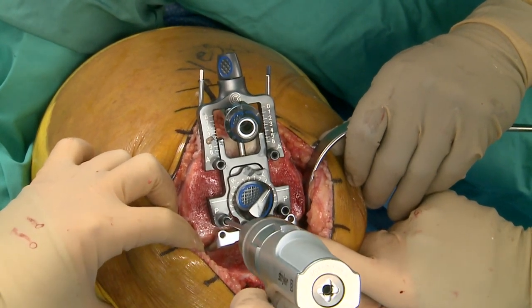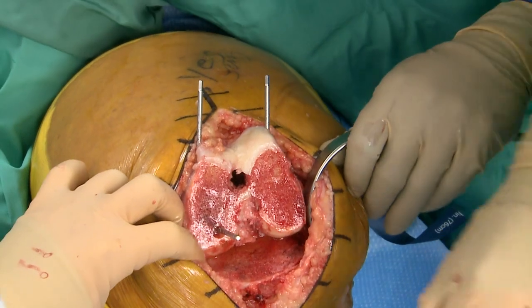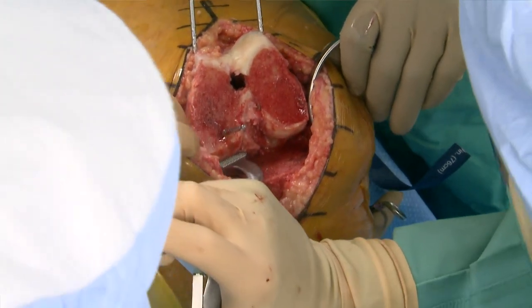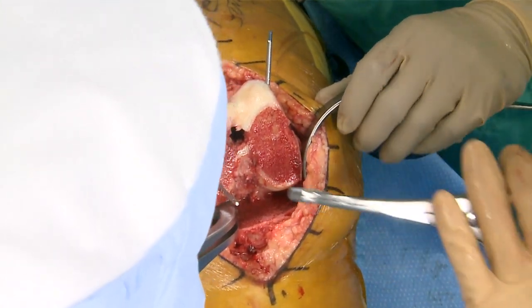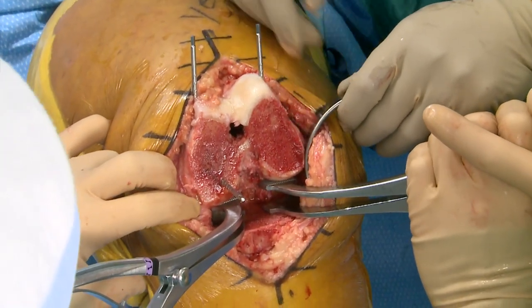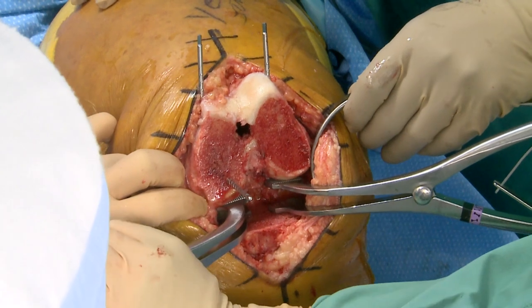I reference the lateral ridge for anterior referencing because if you're going to notch, that's usually where it happens — so I reference that highest point on the lateral side. Now we put a pin in on the medial side. Rotationally I'm rotating around the medial side because I want to keep the posterior medial thickness pretty much the same as the implant thickness — maintaining the posterior medial side, similar philosophy to what was done yesterday.